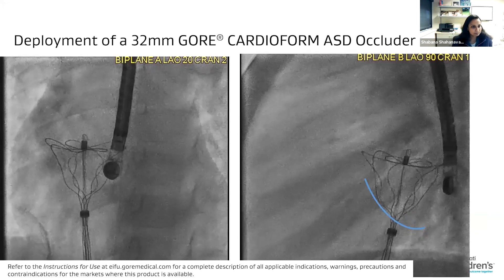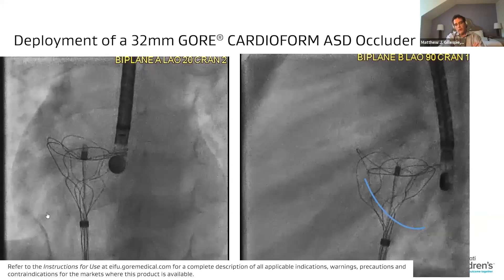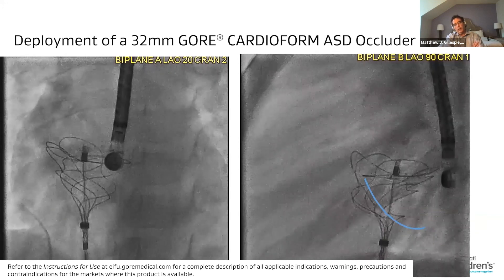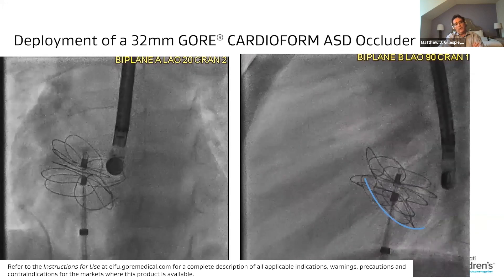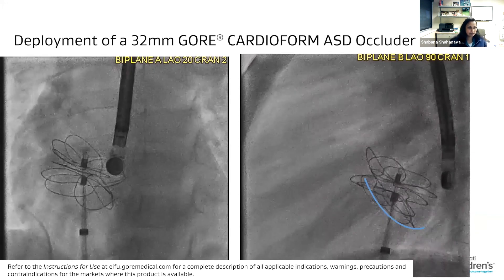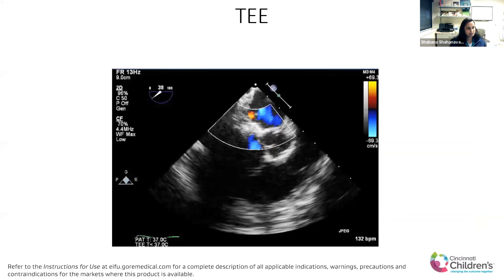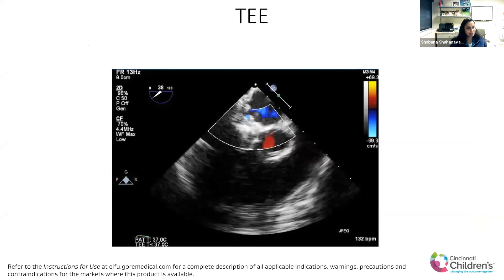Your left panel here really shows it nicely. As you rotate it around, you can see the tuliping of the LA disc as you're pulling back on it. Then the LA disc comes out and you see very clear separation between the two discs. Go ahead and lock it. This is what the TEE looked like — it had captured the aortic rim really nicely.